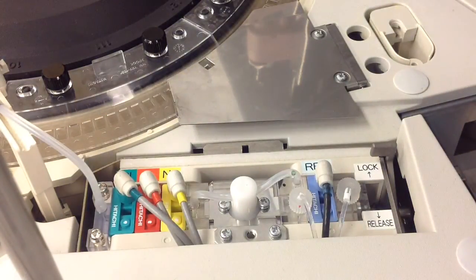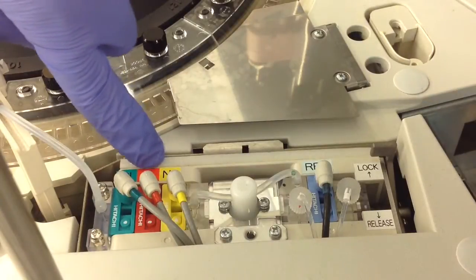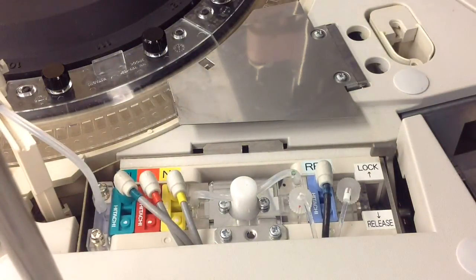From here you'll want to go ahead and run your green rack after doing a reagent prime or two — I did two after this. Then go ahead and run your calibrations and your QC as well, just to make sure that everything's working as it should.